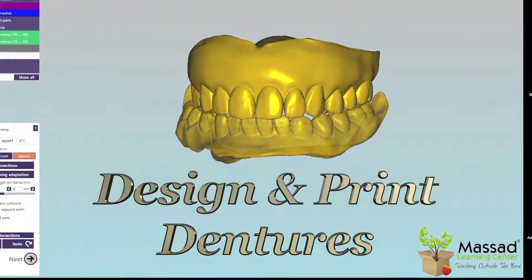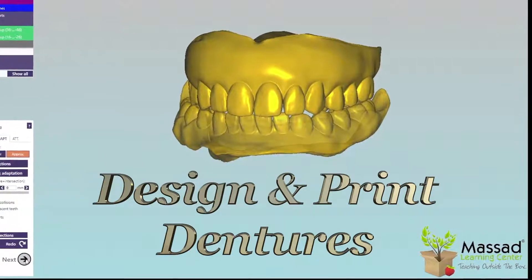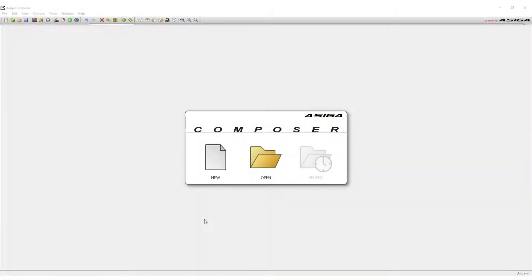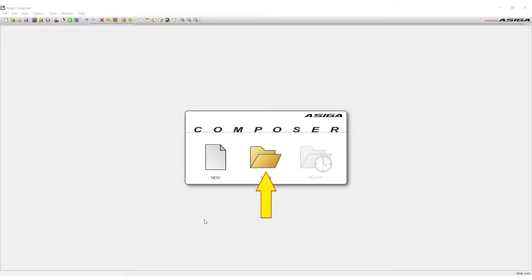After the digital design of the denture, it's time to print the denture. Open up the Asiga Composer software on the computer. If this is the first print of this denture, select New. If working off an older design, select Open. This demonstration has the teeth and bases separated into different print designs. The first print will be the bases. Select New to start the new job.